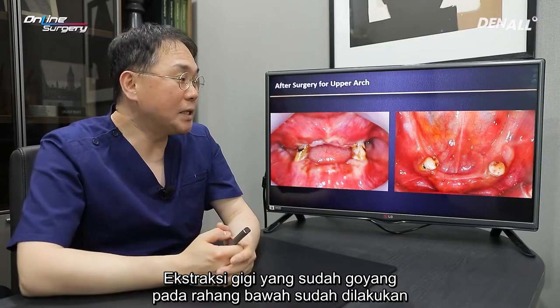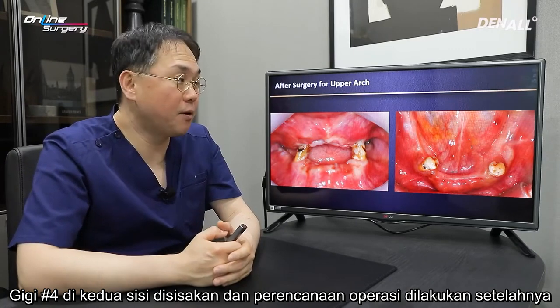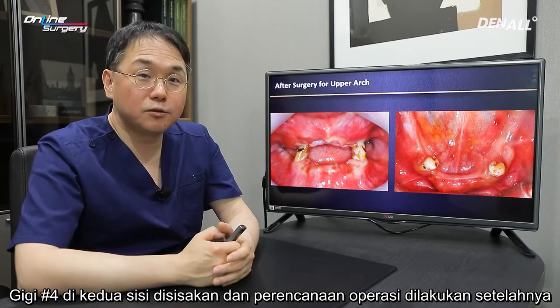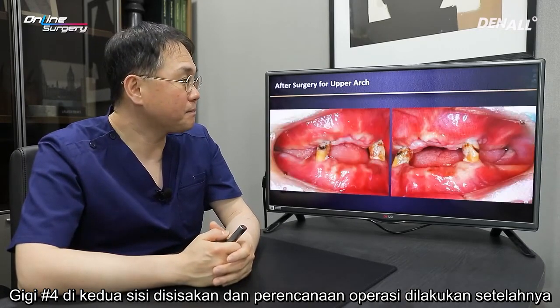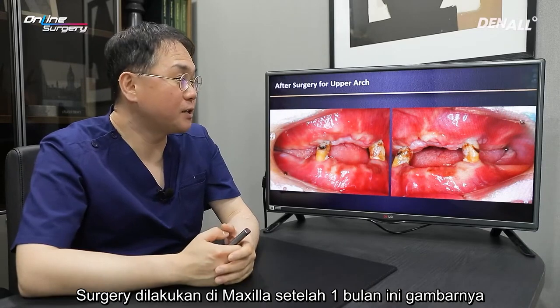Teeth with high mobility in the lower were extracted. Number 4 on both sides were left alone, and the surgical plan was made after surgery on the maxilla, after 1 month. This is the image.